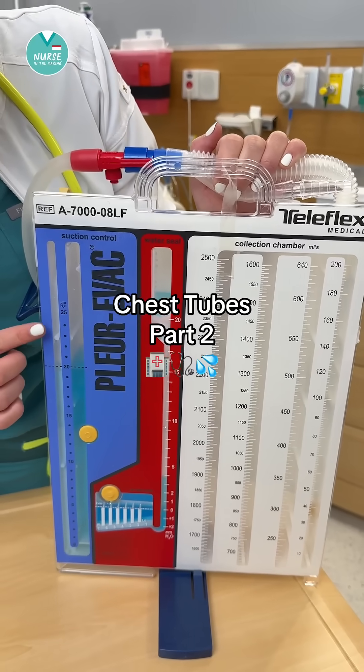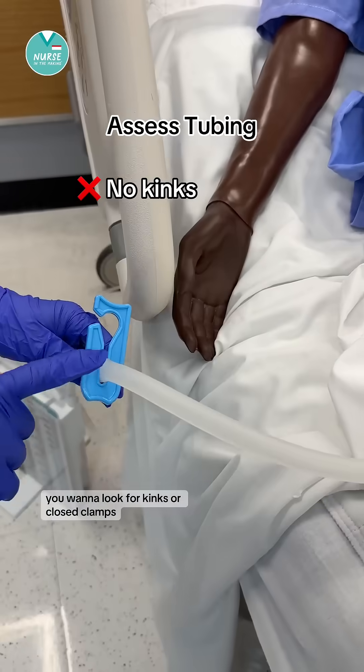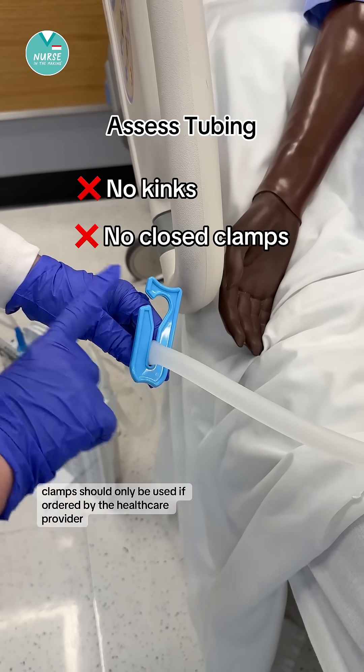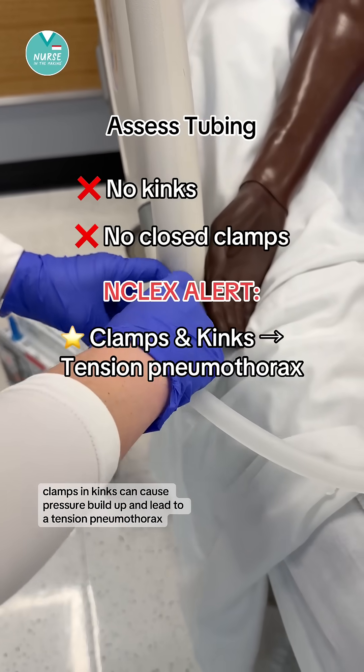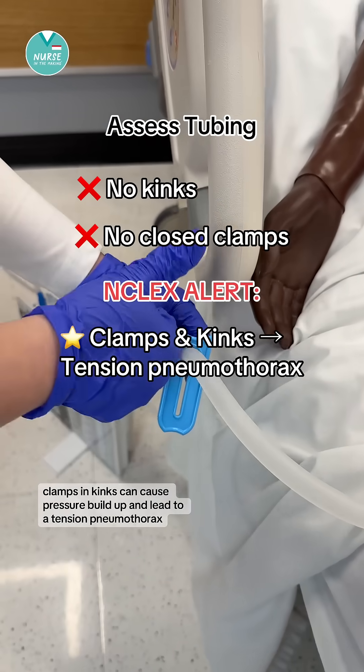Caring for a patient with a chest tube, part two. You always want to assess the tubing. You want to look for kinks or closed clamps. Clamps should only be used if ordered by the healthcare provider. Clamps and kinks can cause pressure buildup and lead to a tension pneumothorax.